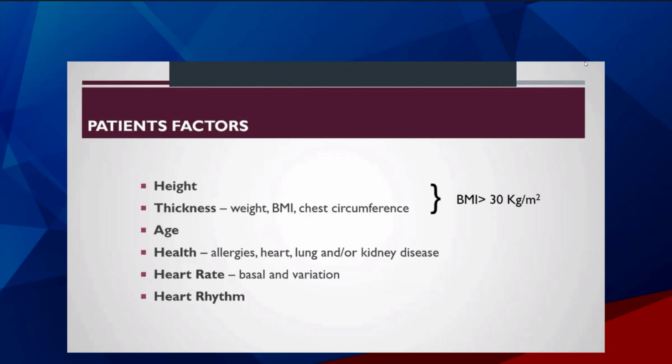Age is also an important consideration when performing cardiac CT imaging. It is not the same to scan a child than to scan an adult patient. Additional standard considerations applicable to all CT acquisitions also need to be taken into consideration, including allergies and kidney problems.